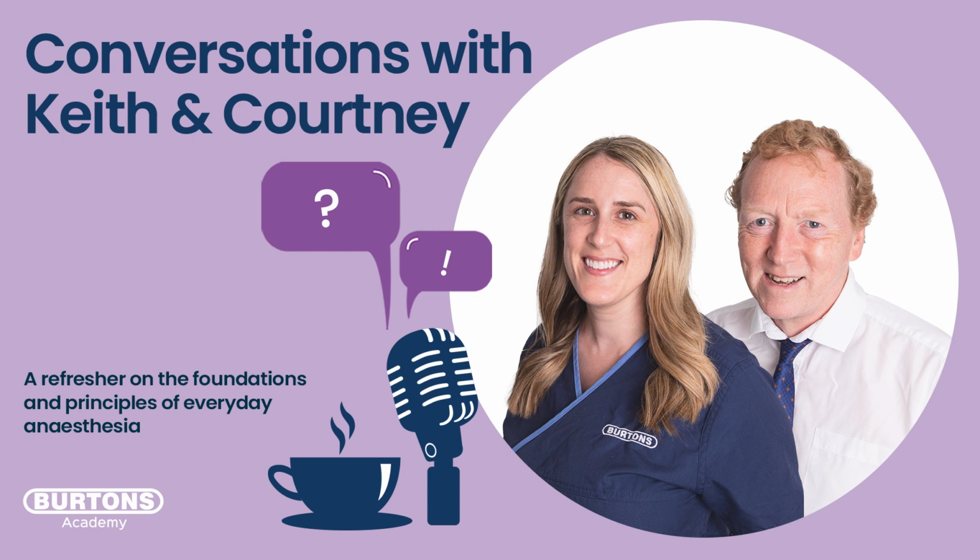And I know that a lot of people are scared of putting a lot of pressure in and popping their patients, but I have seen you blow into a balloon before with a little measurement device there, reaching pressures in your chest of about 75, 80, 85 centimeters of water. So that one-off breath that potentially is a bit too high and a bit much, in reality, it's not a problem.